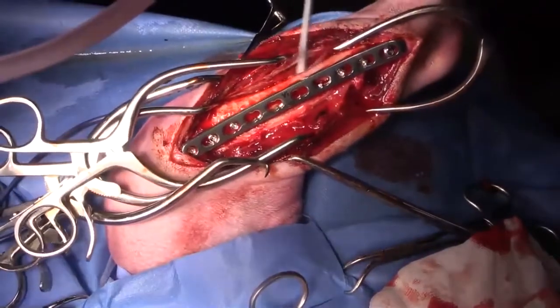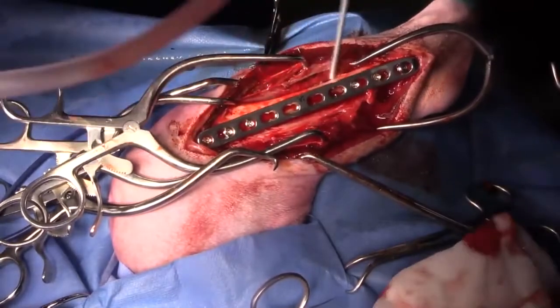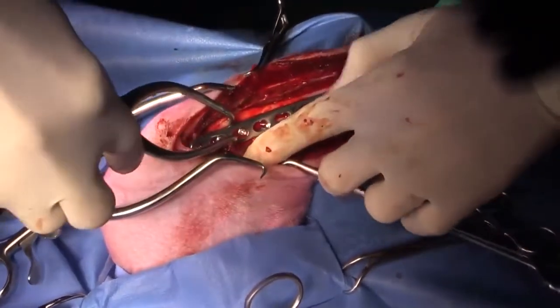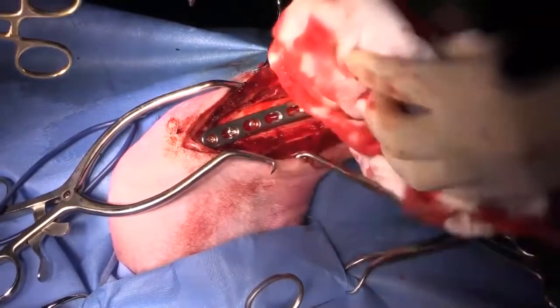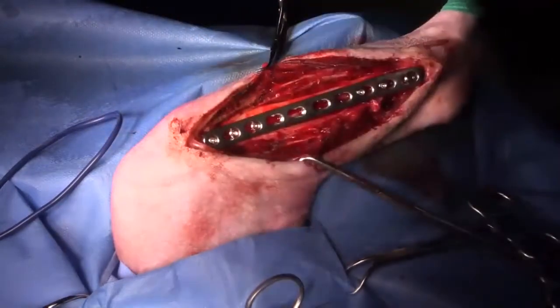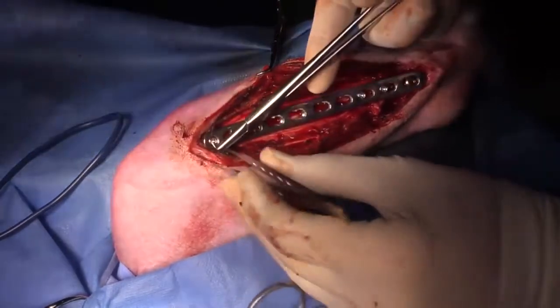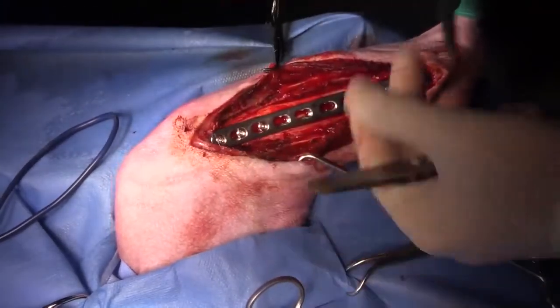You can't even see that fracture — that's the fracture site right there, and you cannot even see it. So just to show you that we did not need the cerclage wires. We'll just wrap that periosteum back around that bone and it'll be healed very, very quickly. On the last case somebody asked me whether I was going to be a gardener or a carpenter, and I decided to be a carpenter because it was an older dog. Whereas this one I decided to be a gardener, because this is going to be healed so quickly and we've got that nice healthy periosteum — less concerned about getting absolute anatomic reduction, although we managed to accomplish that anyway.